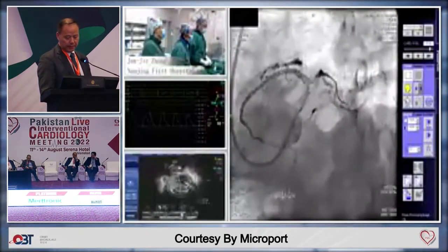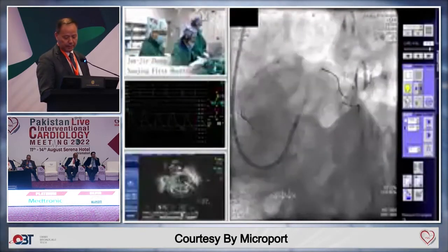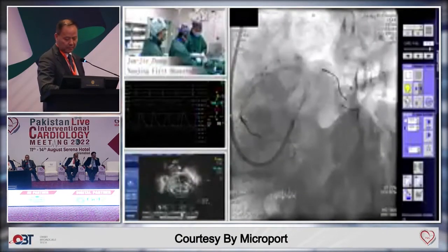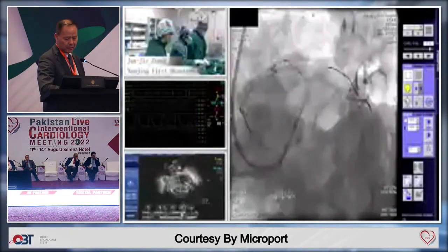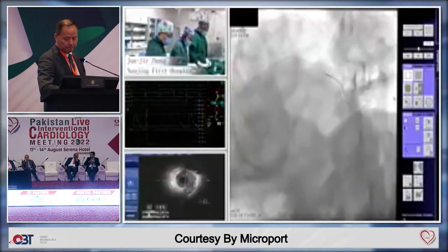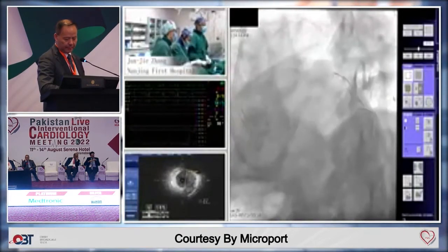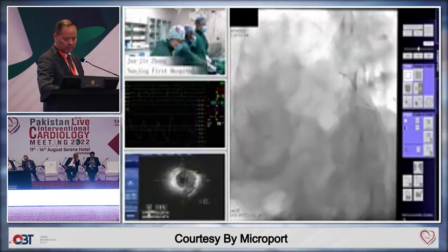So next will be the first stent, obtuse marginal with short protrusion into the left main, right? So what's the size of the side branch stent? 2.75? Yeah. According to the IVUS evaluation, a 2.75 by 23 stent will be deployed from the OM to the circumflex with minimal protrusion into the left main. At the same time, I will put a 3.5 NC balloon at the distal left main, which will be used to crush the circumflex stent.